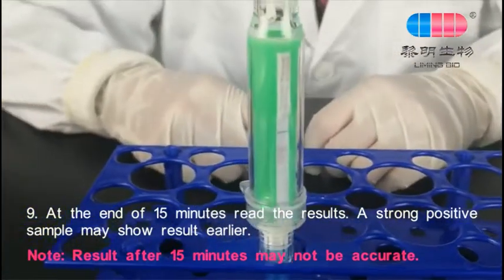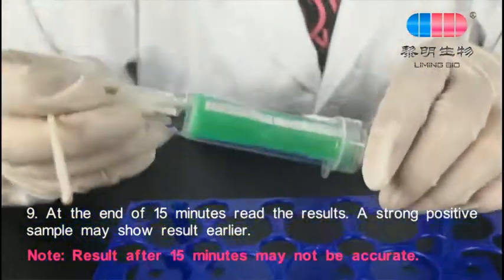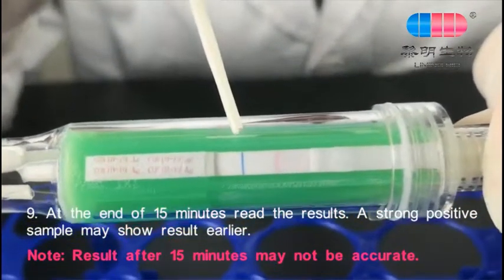A strong positive sample may show results earlier. Results read after 15 minutes may not be accurate.